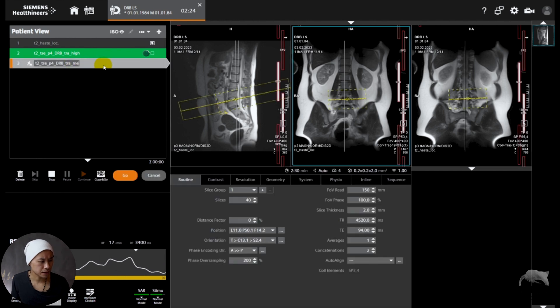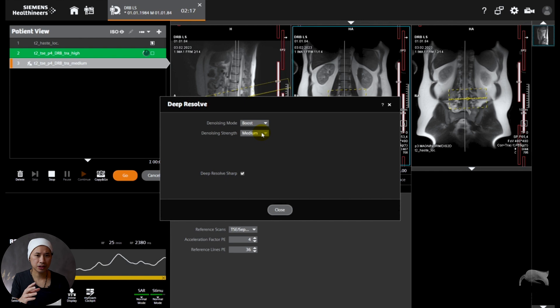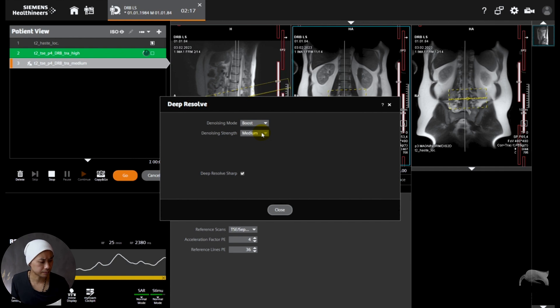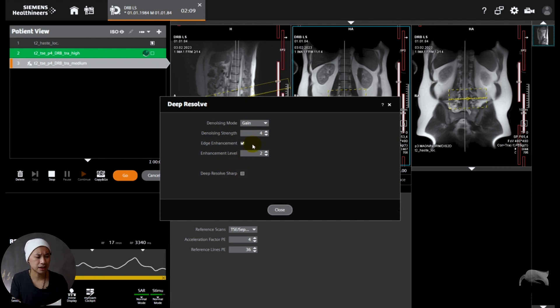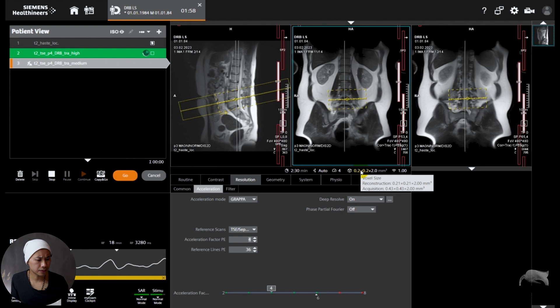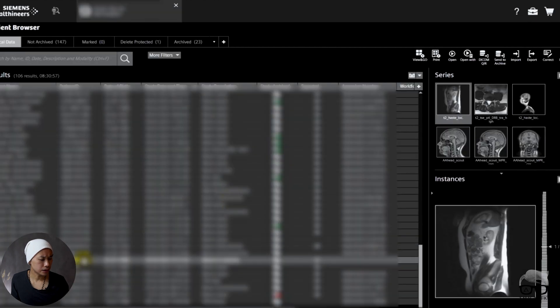Like I said, I'm just going to do one scan and then retrospectively recreate all the different images for comparison. The next setting would be Medium, but I'm not going to scan that separately — because if I scan different denoising levels (low, medium, high) individually it takes a lot of time. So I'll just do one scan called High and then retrospectively turn it on and off to get different variations of the deep learning to compare. This saves scan time on the scanner. I'm also using a high PAT factor of 4, a resolution of 0.43 × 0.43, 40 slices, and 2mm slice thickness.